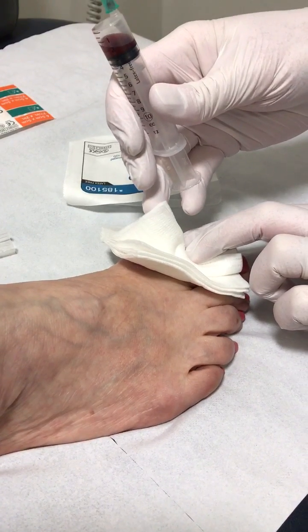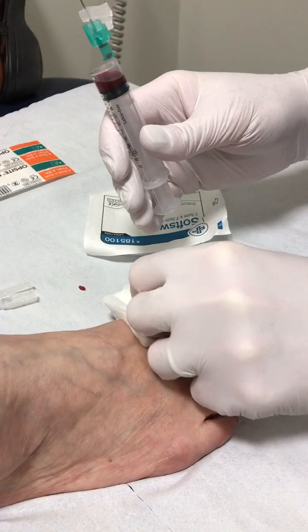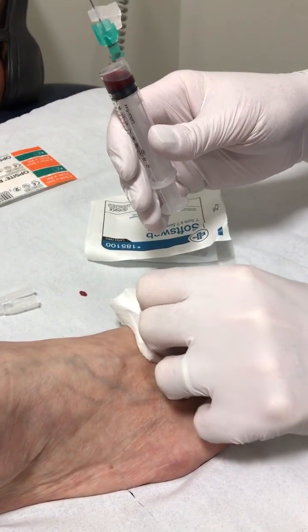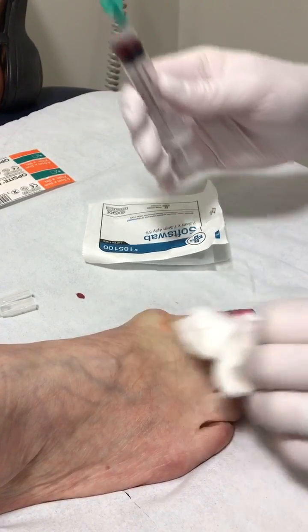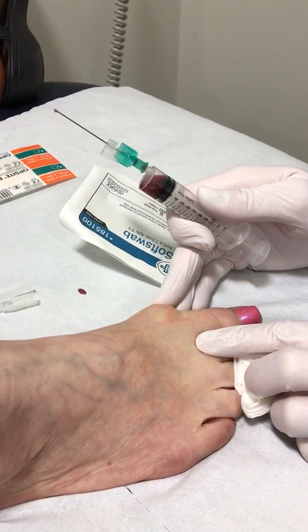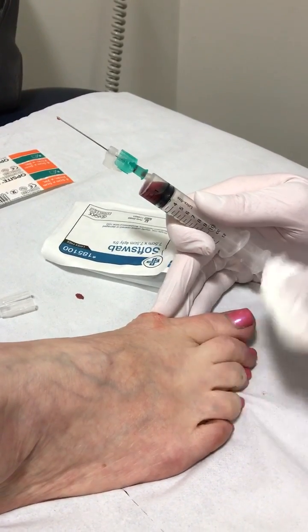That one's had a bit of trauma, so that's why it's a little bit more — it's normally a little bit more like wallpaper paste. But that one's got a little bit of blood in it, so it's had some trauma from the shoes. It's effectively a bit blood-filled, but that's mostly gone now. Super, that'll do it — thank you Jake!